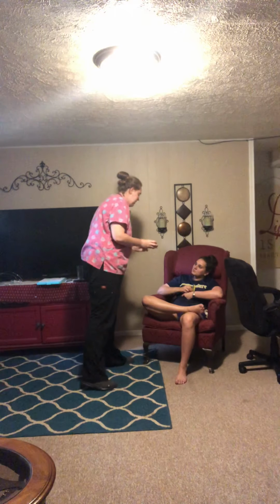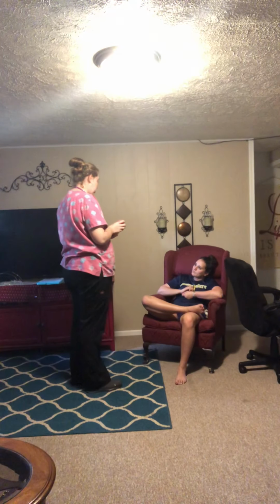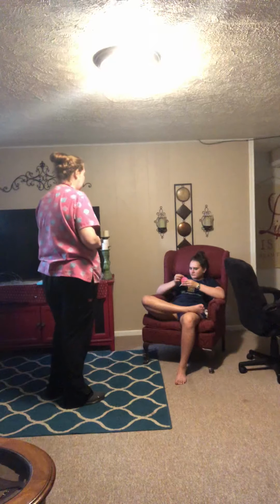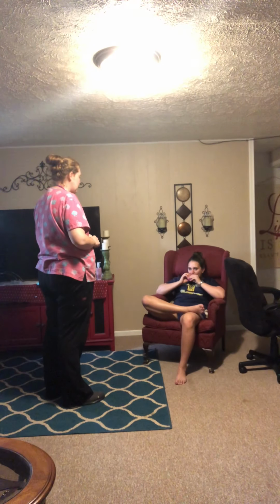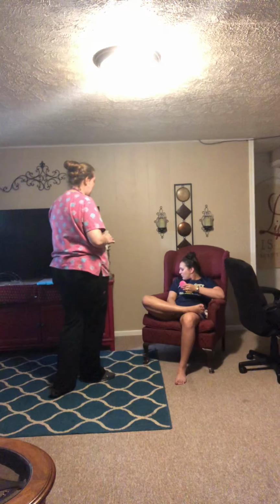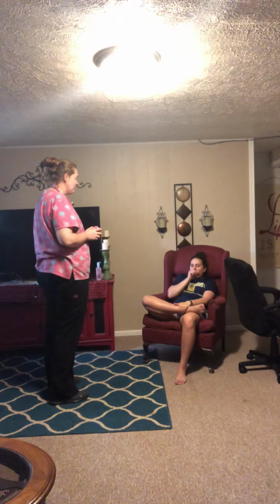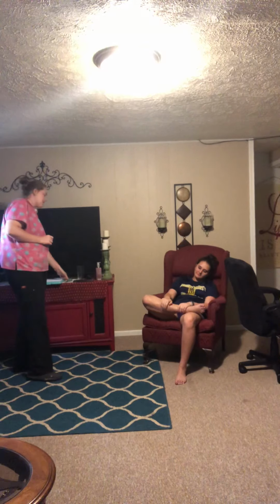And then right here you're going to see that there's a dose counter on the front. That lets you know how many doses you have left before you need to refill it. Okay. So go ahead and take that now. Go ahead and take that deep breath out to the side. Very good. Wrap those lips around there and take a deep breath in. Alright, and hold that as long as you can, about 10 seconds, and perfect. And go ahead and exhale to the side. Very good. Alright, and can I have you take a deep breath in and cough for me? Okay, super.